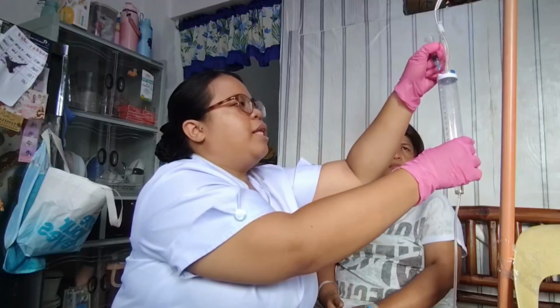Okay, after incorporating the drug, make sure to set this aside and then make sure to properly dispose it afterward.